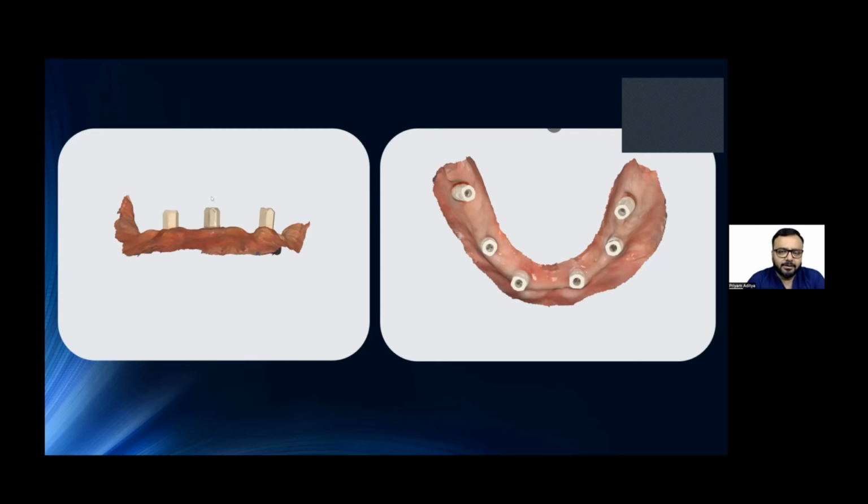The key factor for a successful scan is adequate soft tissue management. And this is very, very important. I cannot stress enough on this. Please understand that as a human, we can understand that this is gums, this is teeth. The software, the AI is catching up, and they are also able to recognize a lot of things, but a human eye is still beating AI as of now.